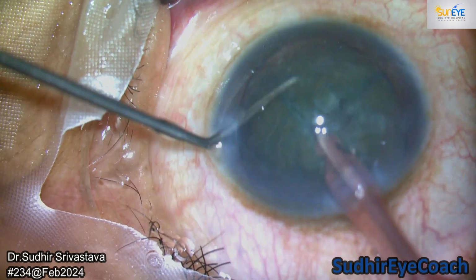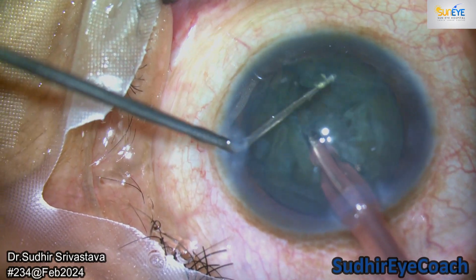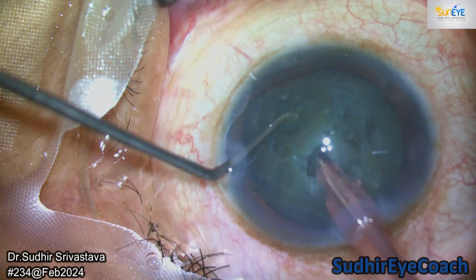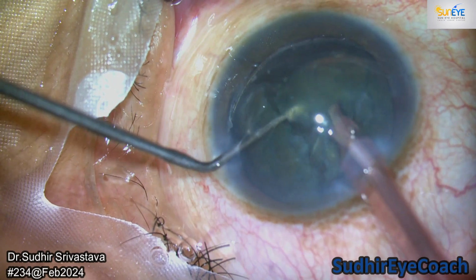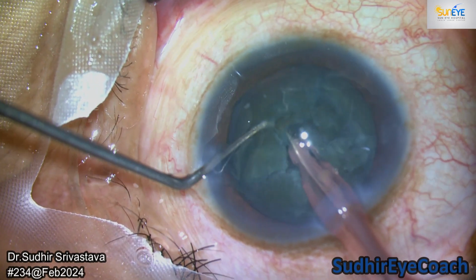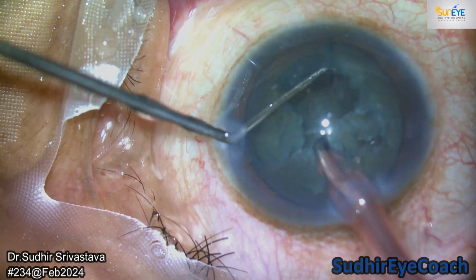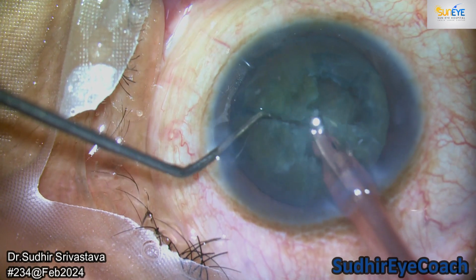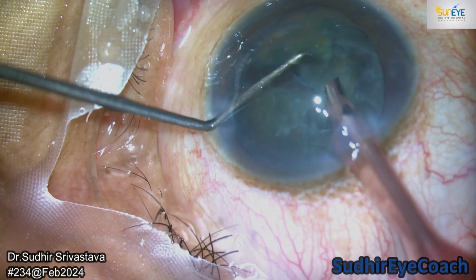Your foot control is very important in such cases. Always keep control of your nerves and gently continue. Always look that your chamber is properly maintained. Hold the nucleus fragment and try to divide it so that you give less traction in the weaker area of the zonules.